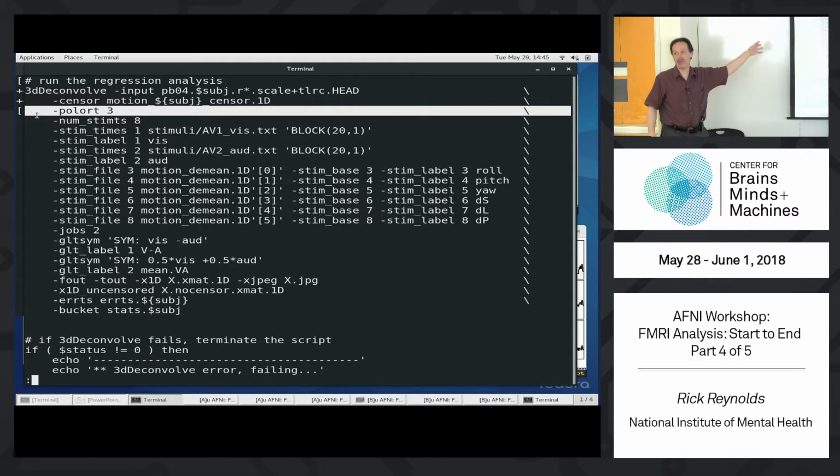So in this case, we have 2 classes. We have big response curves. We have a lot of data points. We could probably censor a fair amount of this and still have a robust model, get a robust result. But if some of your stimulus classes of interest only have a handful of events, or especially in a faster event design, losing a handful of time points in the fast design model is more damaging than in this slow one.